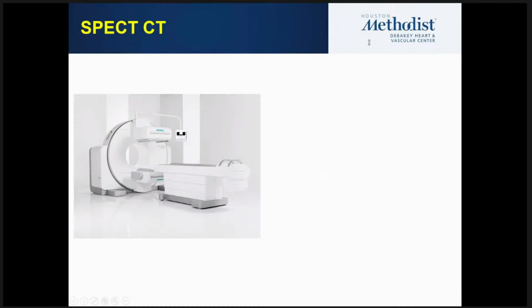Please also during the lecture send questions, and for our colleagues asking the questions via Zoom, hopefully we'll be able to answer. SPECT imaging relies on two heads.